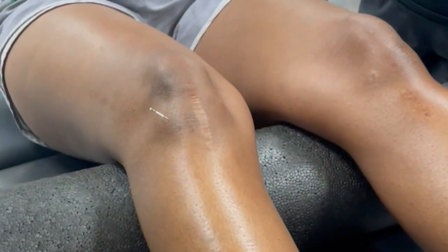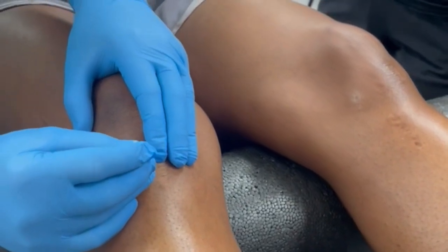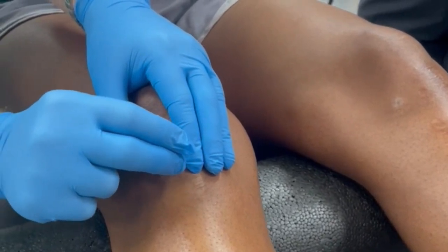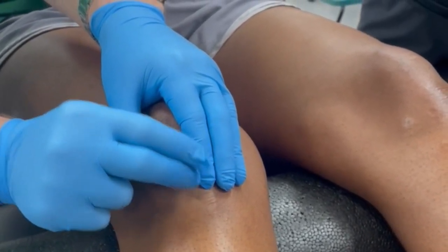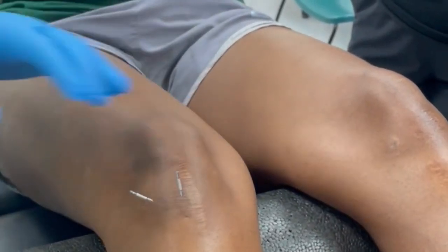Keep that in. What sizes are you using? I could have used a 15, but I just didn't have any with me, so this is a 30. Now through the gumminess of the tendon insertion, and now I'm just on the bone. I'm just kind of oscillating that and pecking it, just creating microtrauma with it.